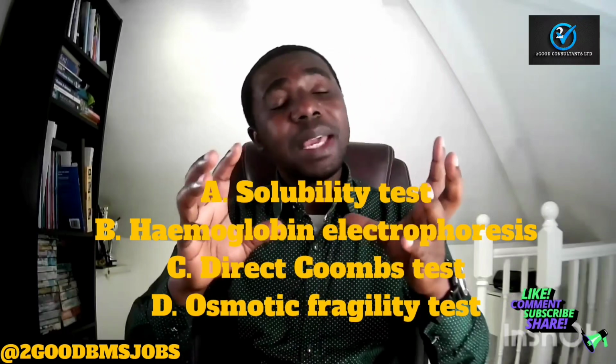So now let me give us background, then I'm sure the answer will just come up quickly. In a case where we are suspecting that a patient might be sickle, there are a number of reasons that can lead to that. Let's say we've done a full blood count of a patient, and the hemoglobin and some of the rest of the indices suggest something along that line.